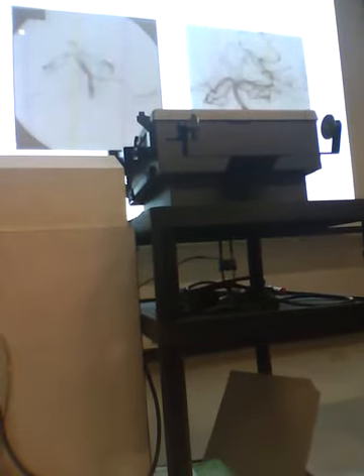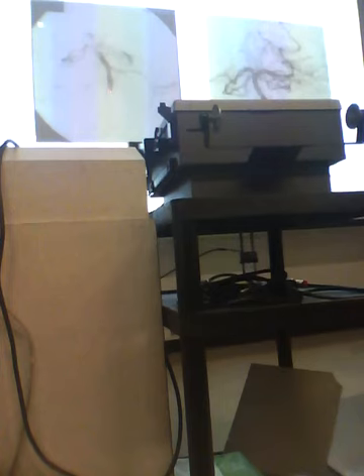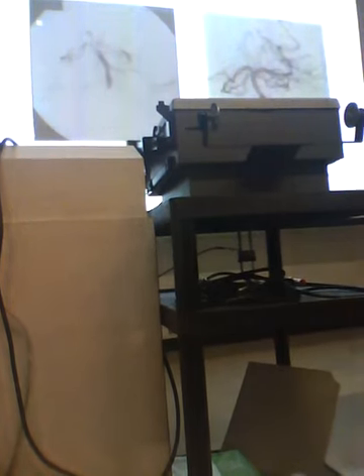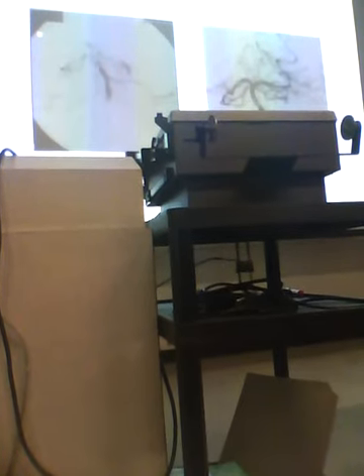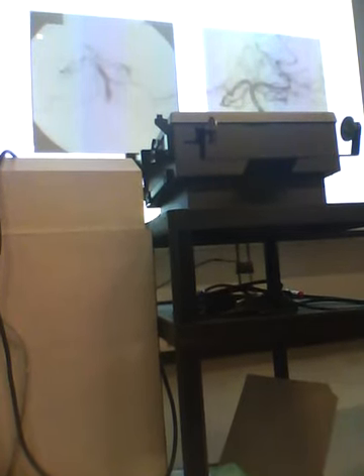And here's the case where they put the catheter in, here's the catheter going in here to inject the dye into the arteries. And this is a patient that had a blood clot. He had a stroke where a blood clot was clogging up the basilar artery up here. And what you don't see is much network of blood vessels at all here. Then they've injected a compound, and again, you're going to learn a lot about this when you do the lectures on stroke, called TPA, tissue plasminogen activator.